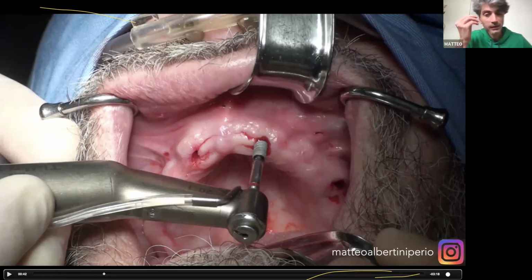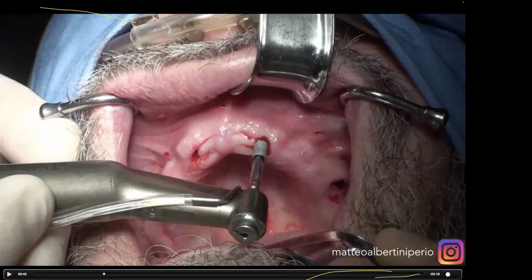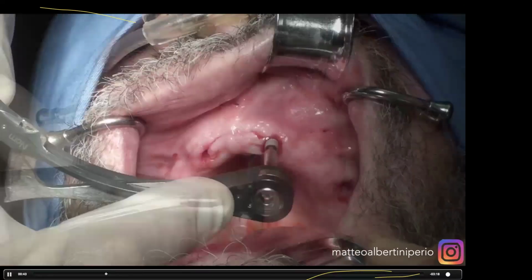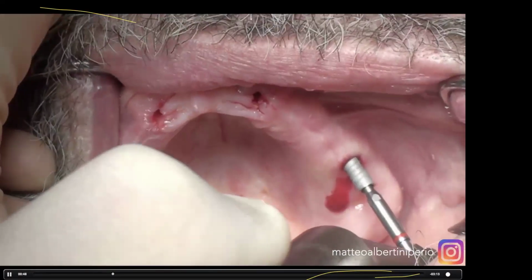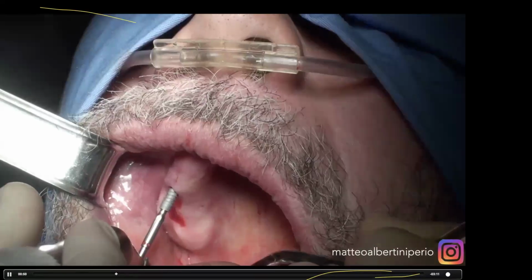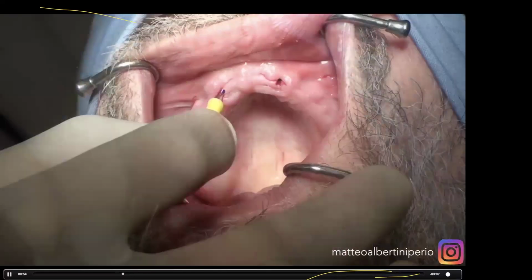So sometimes it's easier to put the implant without the guide. Да, поэтому, если мы планируем проводить одномоментную нагрузку этих имплантатов, бывает такое, что при установке имплантата по шаблону мы не получаем достаточного торка, и потом мы меняем имплантат, поэтому в такой ситуации я предпочитаю установку самого имплантата уже без шаблона.